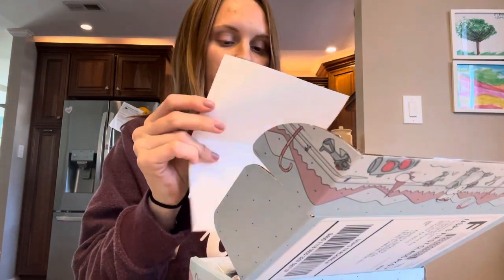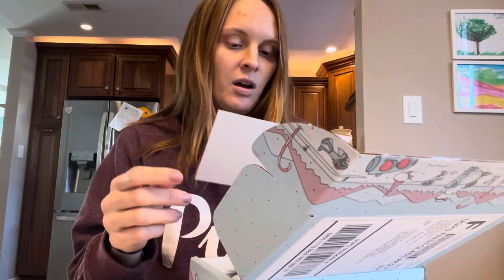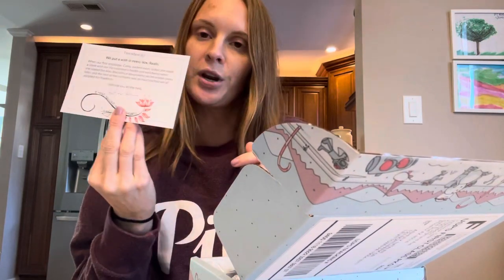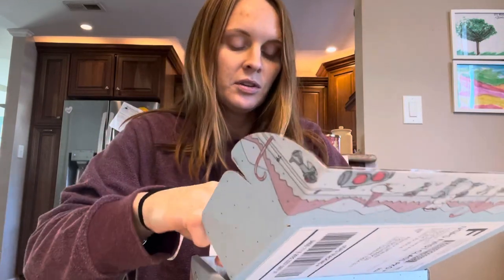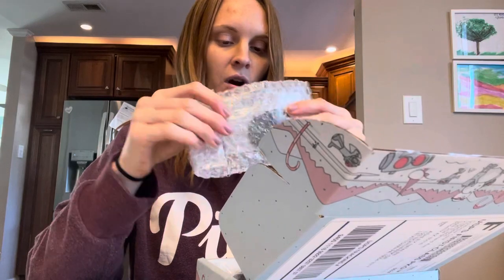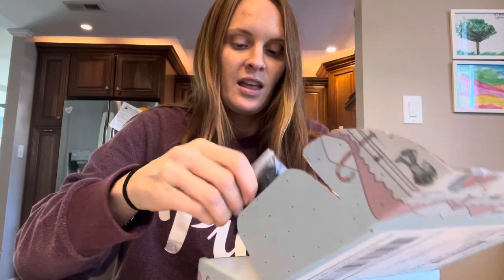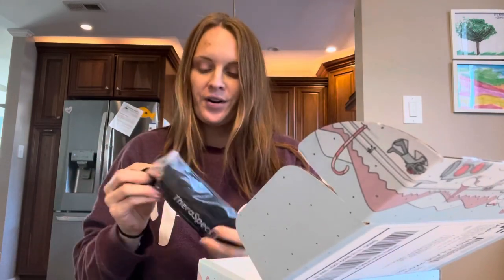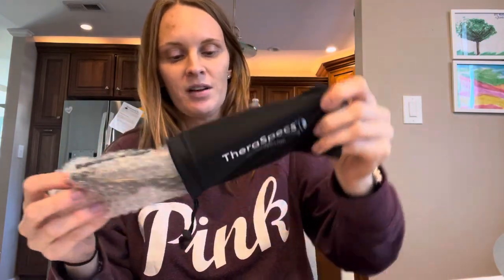Inside the box there are a few business cards to spread the word, some directions, a little cute handwritten note, and they always come with one of these little mints. These are my original frames that they took out, and here are the new ones. I like a good soft case because I can throw it in my purse without it being hard and bulky, so I'm happy it comes with a soft case.